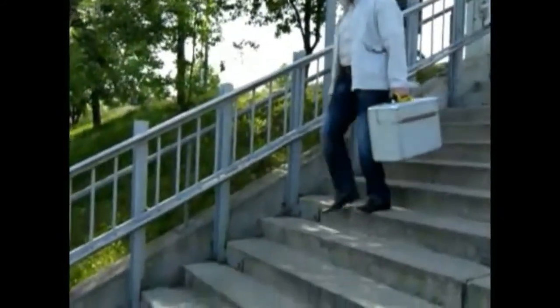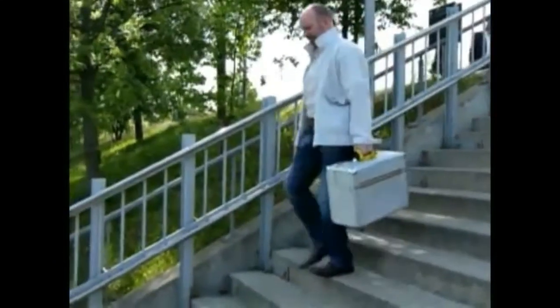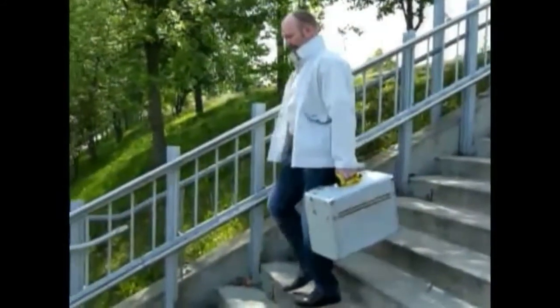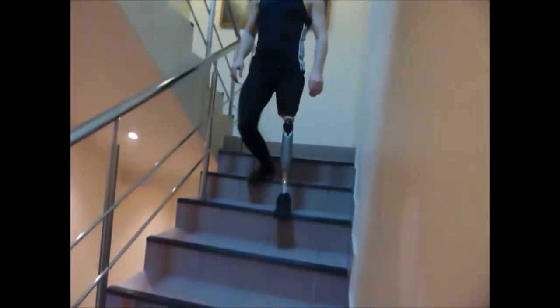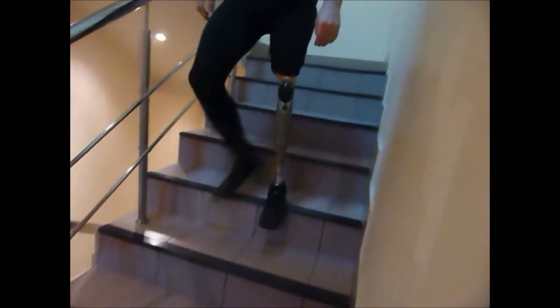What he's doing is he's riding the knee in stance. He never allows the knee to go to full extension, so he never gets a toe load, so he can always just ride the bending of the knee. This is another stair example to give you an idea of control and the use of the VGK.